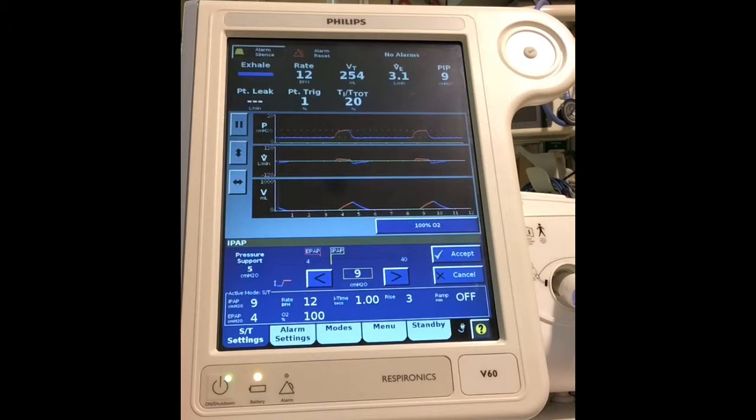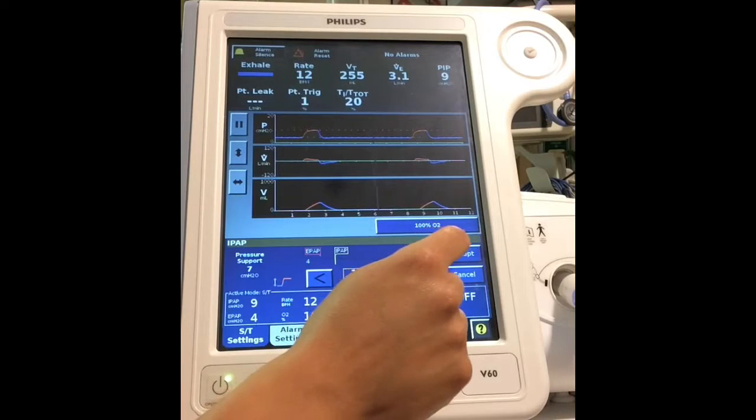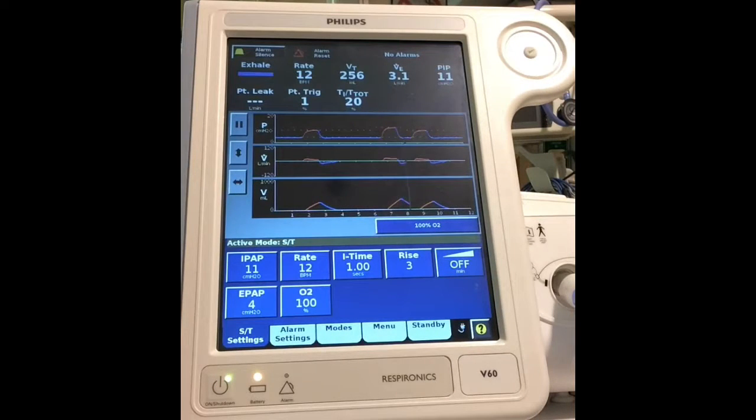Normally it's 1 to 2. If we still need to go up by 200, let's increase it by 2. So I go up to 11, and I allow that machine to give a couple breaths, and I see what our tidal volume is. You can see it's starting to increase. We're getting close to that 300. It's still not close to that 450.